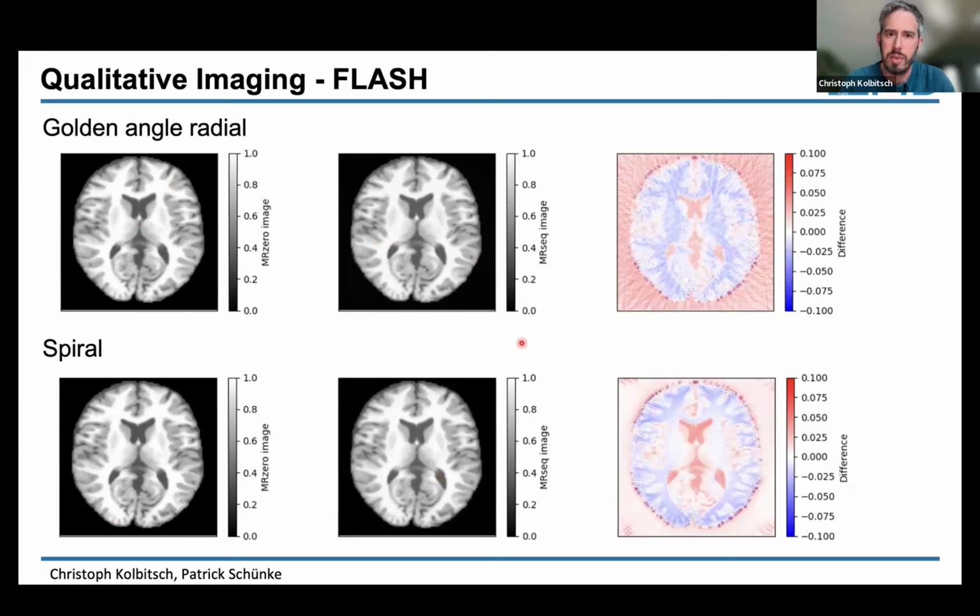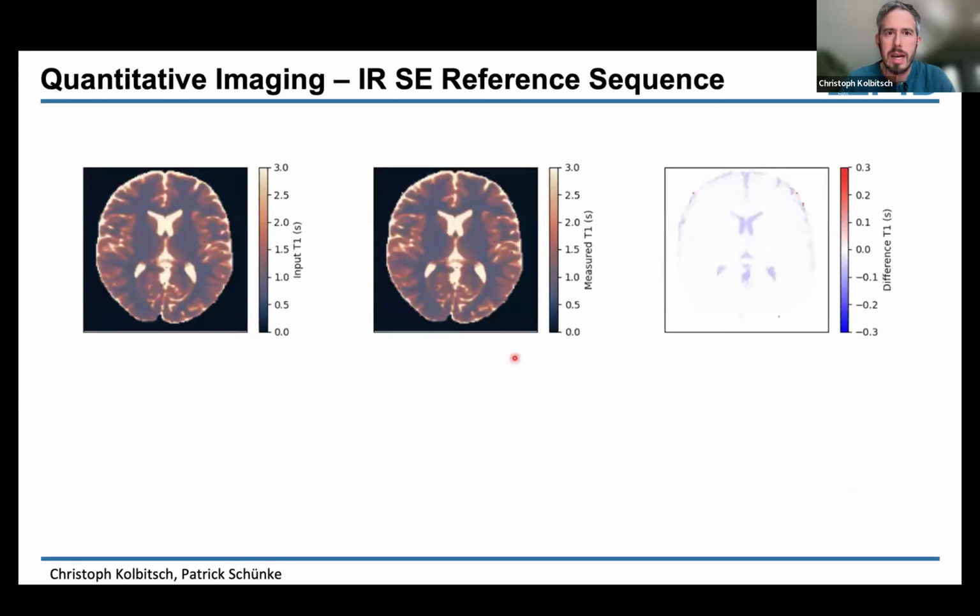And this is all done automatically. So whenever we do a PR, we have an automatic script which then runs through these examples and verifies that the overall error is below a threshold, and only then can you actually merge something into the code base.